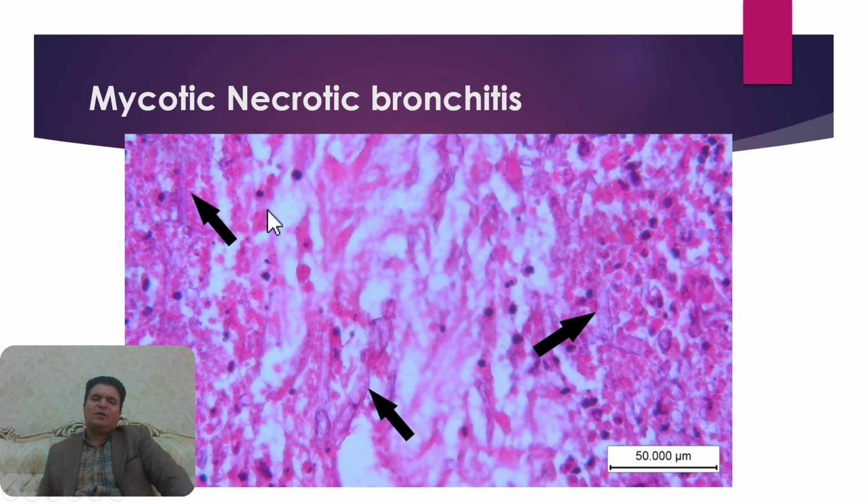This photo is higher magnification of the previous photo. This slide shows a longitudinal section of mycotic hyphae here, and this part. You can see fungi hyphae. So I called it mycotic necrotic bronchitis.